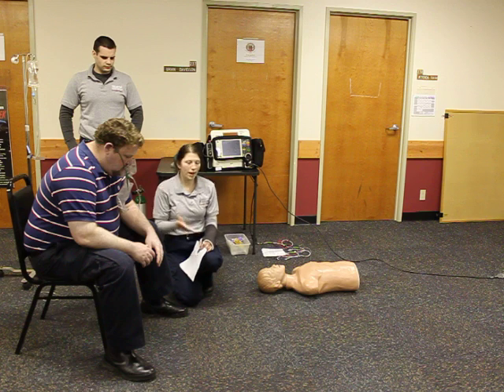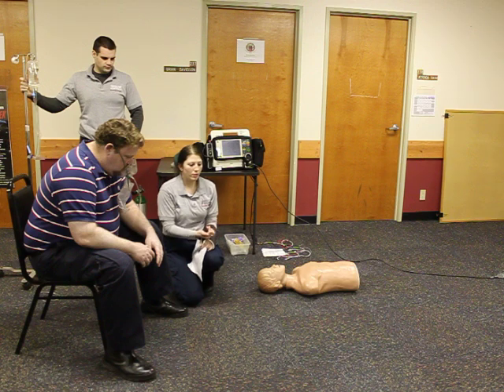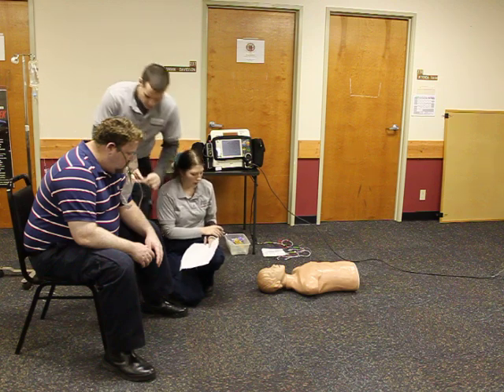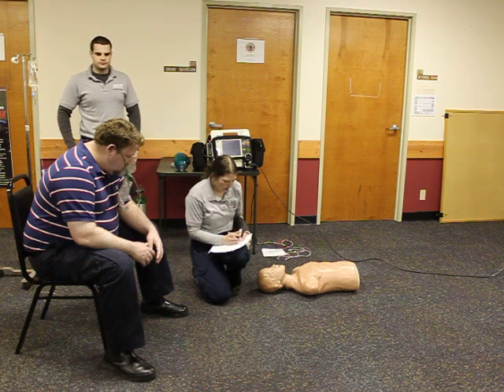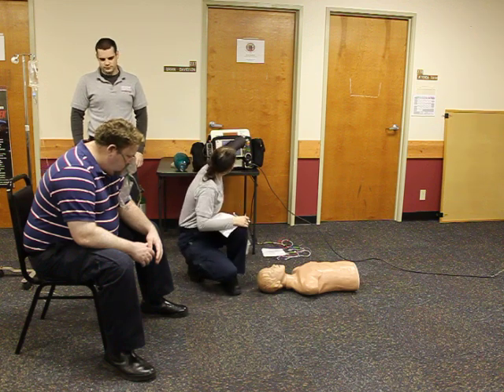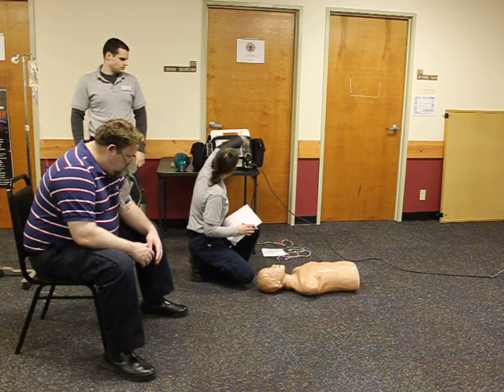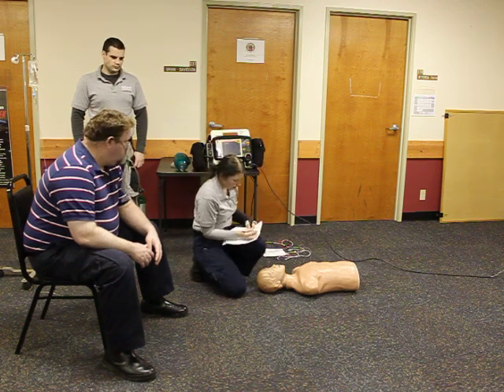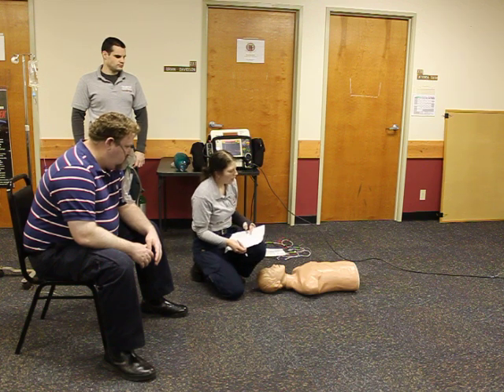So I'm going to move him to the back of the ambulance. Once we're there, I'm going to place him on the cardiac monitor, have my partner start an IV, and at this time, I'd like to get a first set of vitals. What would you like? Blood pressure? 92 over 68. Respirations? 24 shallow. Pulse rate? Monitor shows a rate of 216. Blood glucose level? 90. O2 sat? 97%.